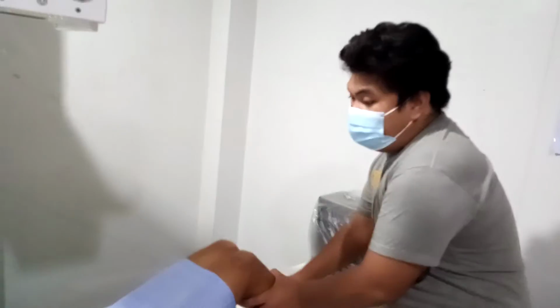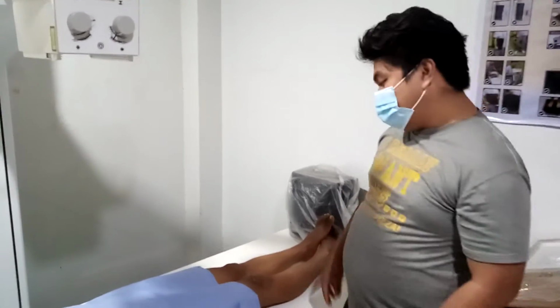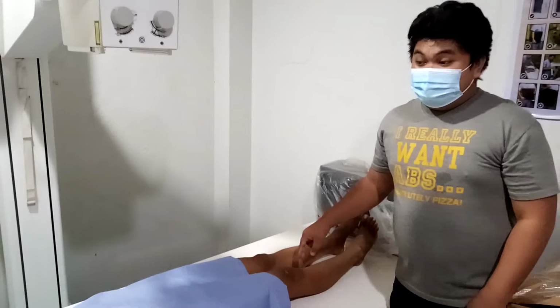The next one is, take note that the AP lumbar spine with legs extended creates an increased lordotic curvature. So if you are going to unflex the knees and hips of the patient, you are going to increase the lordotic curve of the patient.